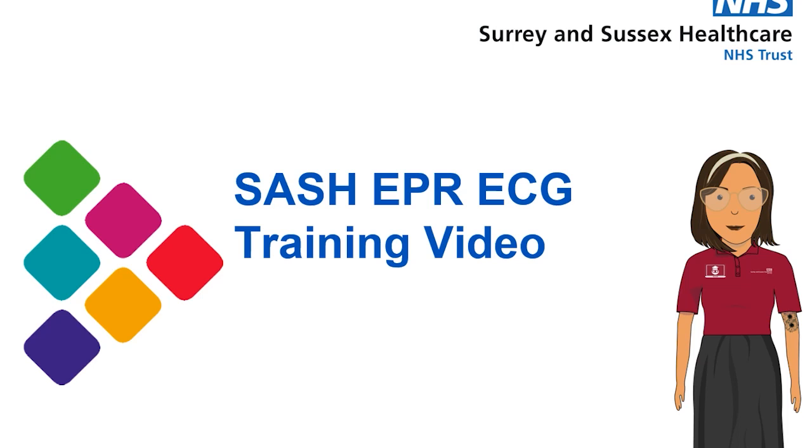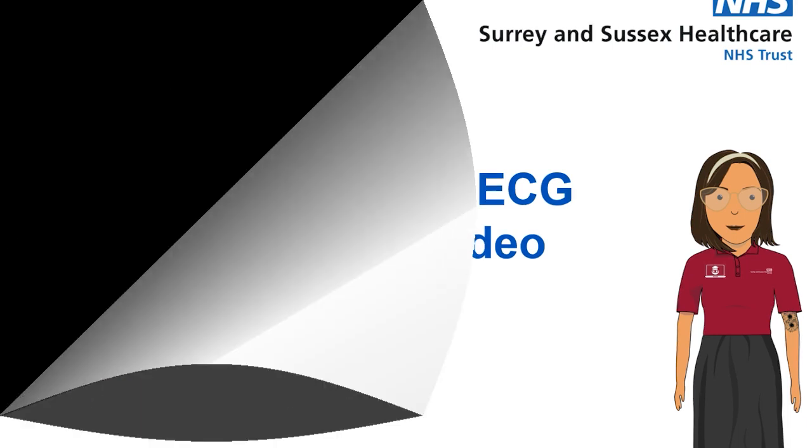This video will show you how to pull the patient's information onto the ECG device and how to transmit the result into the electronic patient record. We will also show you how to view and comment on the ECG within the patient's record.